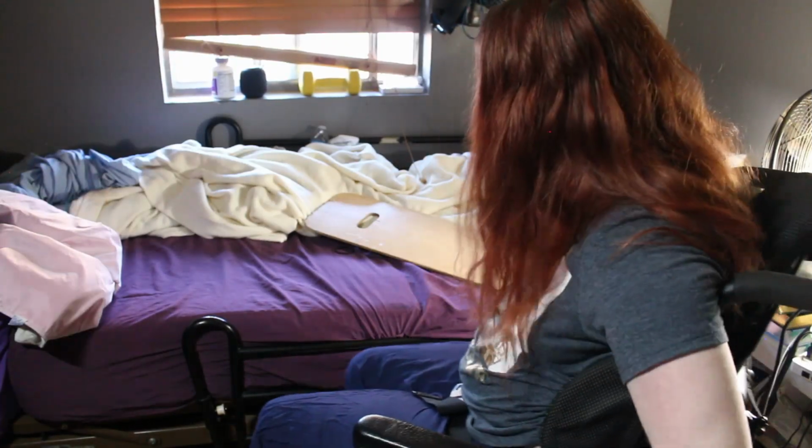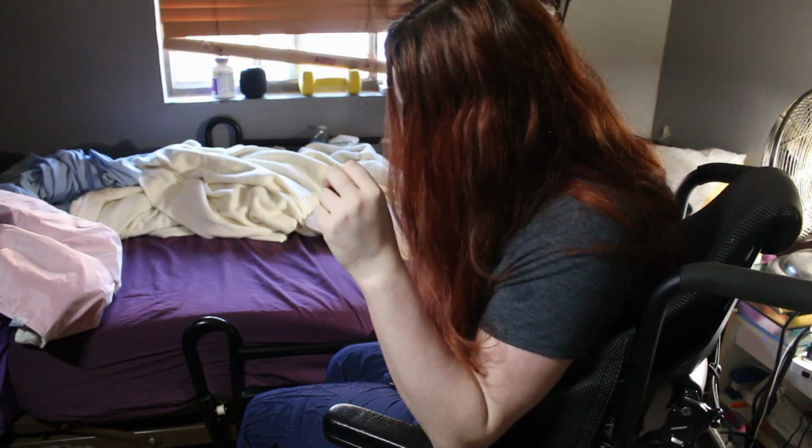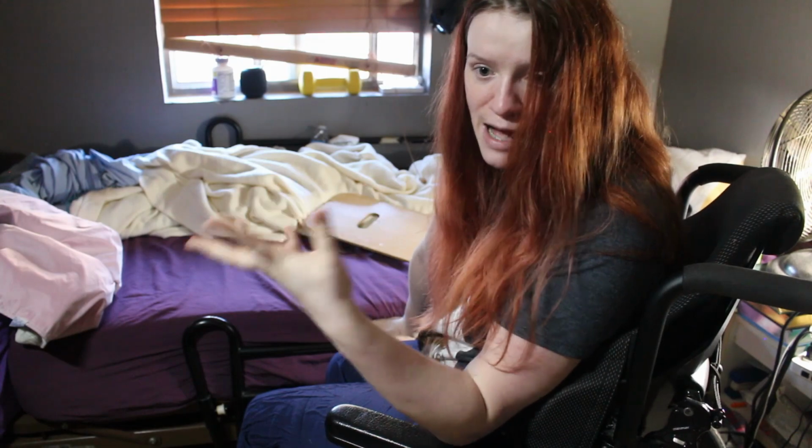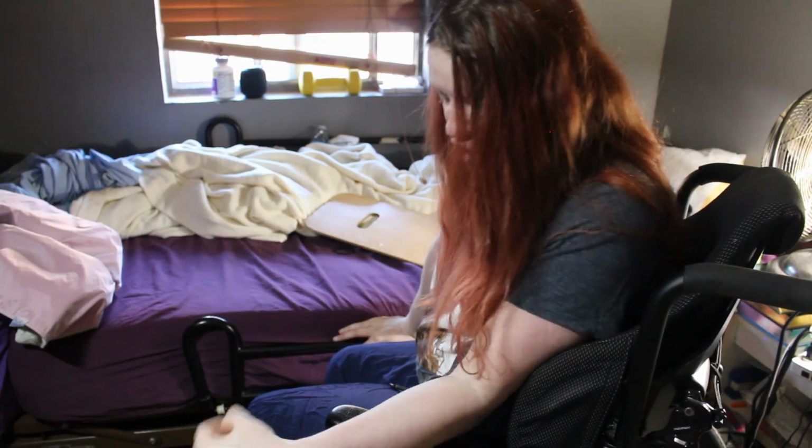To do this, basically what you do is you come to the side. Always remember to lock your brakes, because when you don't, things go badly. I've done this before, and I'm very glad I've always had somebody with me to stop my wheelchair from moving. Otherwise, it would have plopped on the ground. And you're human. Something's going to happen every once in a while. But if you can, always remember, lock your brakes.